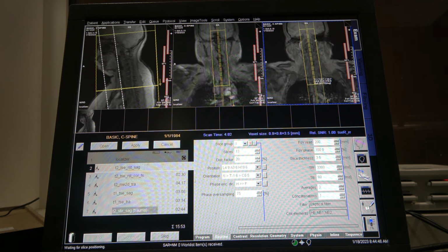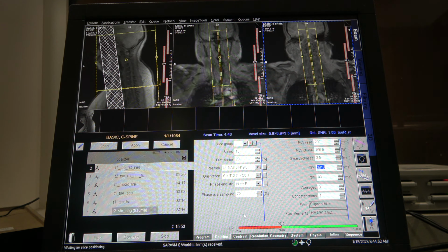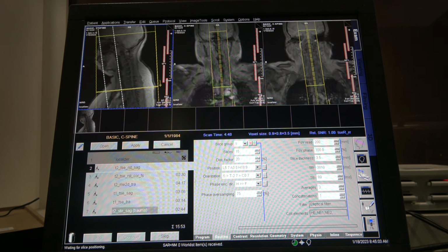All right. You know what? Let's throw in 2 more slices here. Yeah, that's better. All right. My motto is the more the better, right? Because if you don't give them enough, you would have to bring back the patient. Okay.